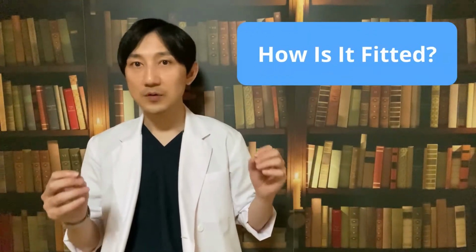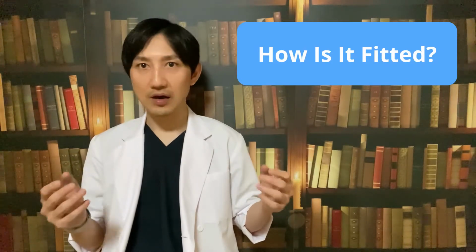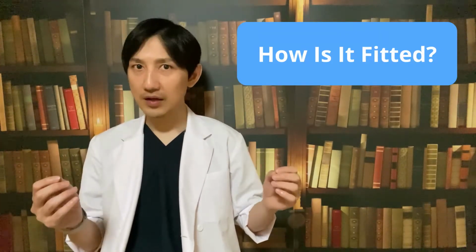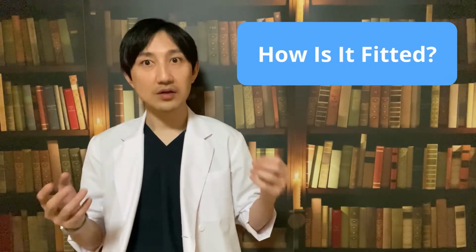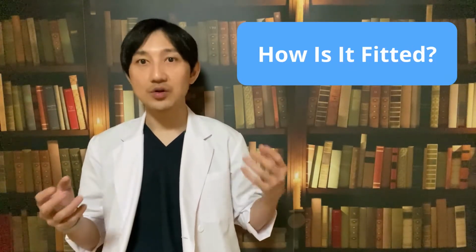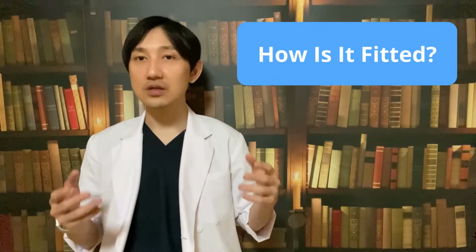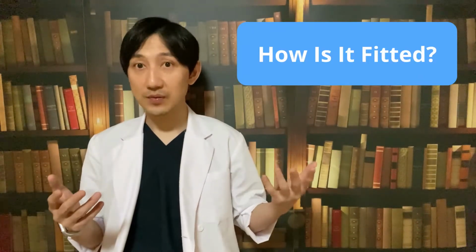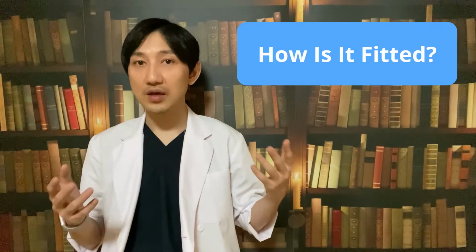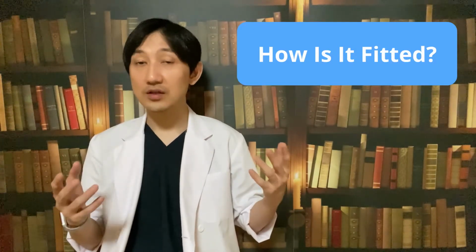Okay, next, how it is fitted. You have to go to a doctor to have an IUD fitted, as specialist staff have to do it. You will have to make follow-up appointments. Before fitting it, the doctor will check inside your vagina to see how large your womb is, and if they find any STIs or other infections during the check, you will be given antibiotics. You should expect the appointment to last up to 30 minutes, but it doesn't take more than about 5 minutes to fit the IUD itself.